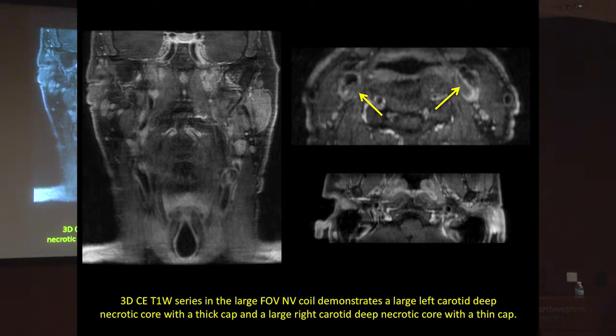We got to use clinical sequences, clinical coils, no fancy software to analyze, and then let's ask a couple of good questions. So part of this was, okay, most of the major manufacturers now offer a 3D fast spin echo, variable flip angle T1 weighted sequence. So let's try using that before and after gadolinium, and let's see how it correlated with our research images. I don't have time today to show you, but basically they correlated very well when the plaque components were identifiable and fairly large. If they're only on one slice, hard to see.